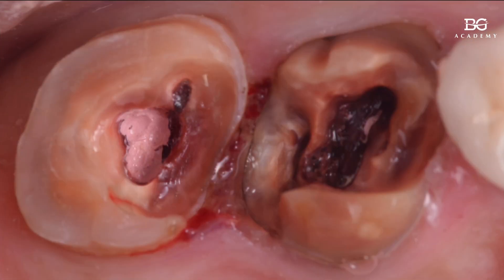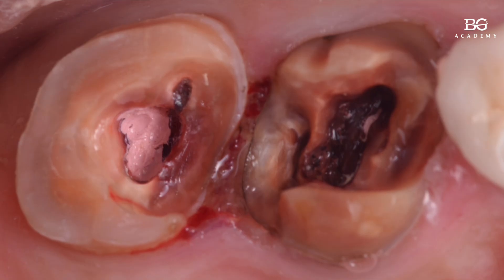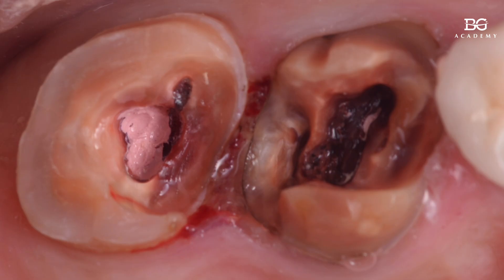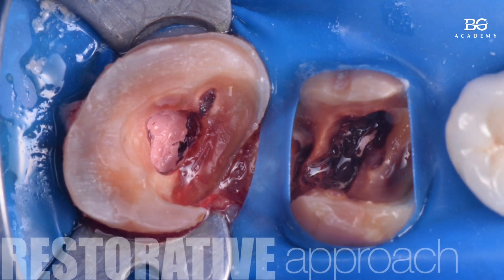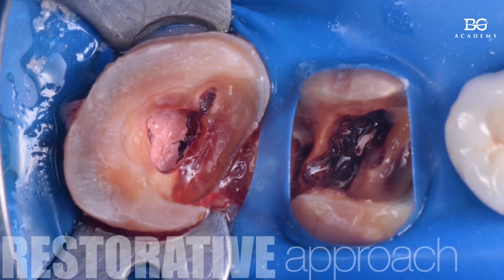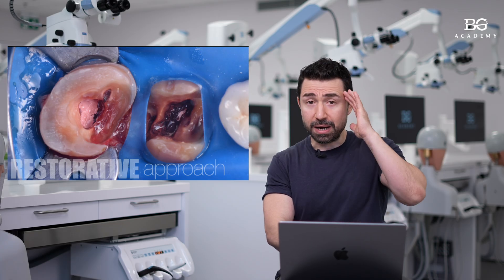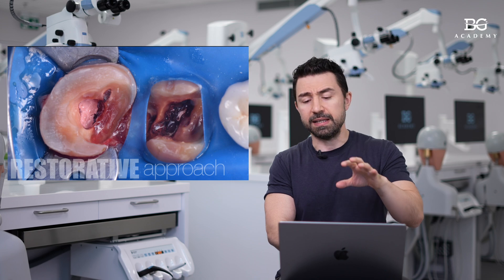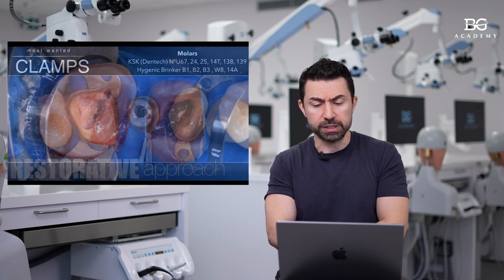After caries excavation and revision of the old restoration, we found the caries was very deep and went into gingivectomy. This process took quite a bit of time. Then came isolation — a real challenge in cases with deep defects. But now my mind is free from the endodontic treatment. I know I just need to restore these teeth first, and then I'll do my endodontic treatment later on.